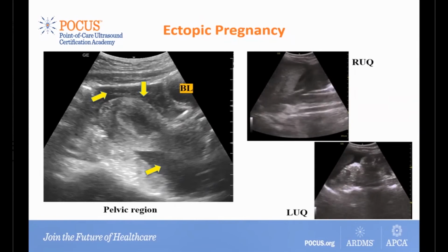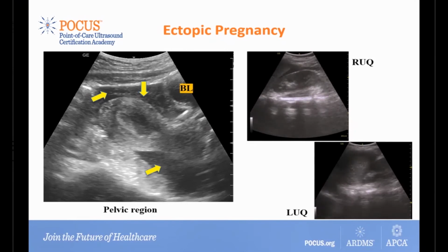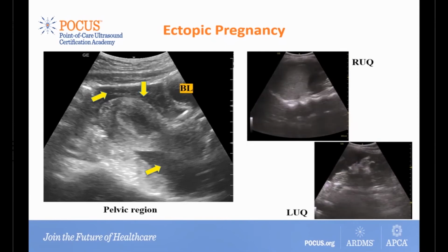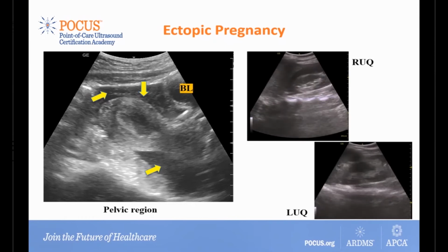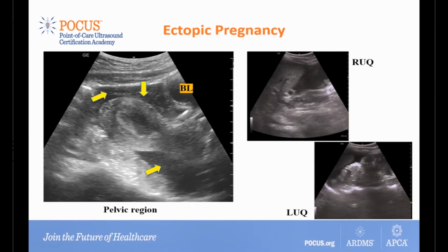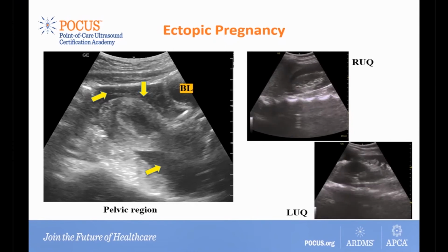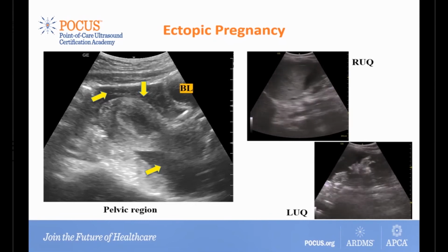Here we can see the spleen, diaphragm, spine, and you can see the left kidney and perisplenic fluid, and you can see even the paracolic gutters. The bowel loops are floating in the fluid. That's all blood. You cannot conclusively say it's blood until you've drained it or done a needle insertion and drained the fluid and tested. But logically speaking, this would be blood because of the clinical presentation and the urine test being pregnancy positive.